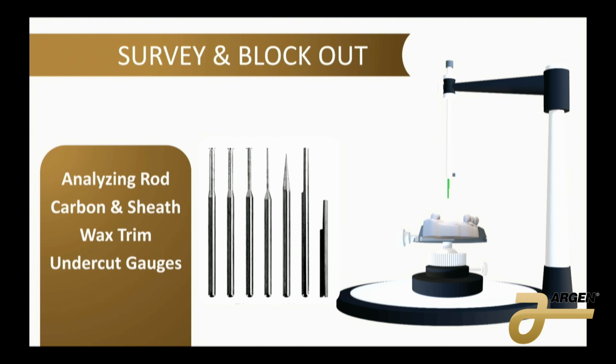Because if you have drawn your clasps on the model, you bring it into your software and you're using the software to block it out and it's slightly different, where you drew your clasps may not now be where that height of contour is, where that undercut is. It might change because we can't accurately replicate the exact same thing.